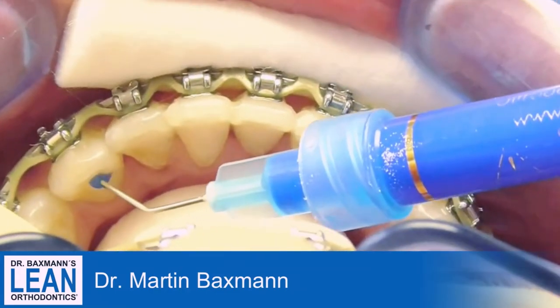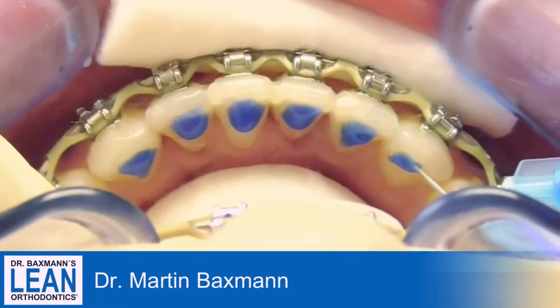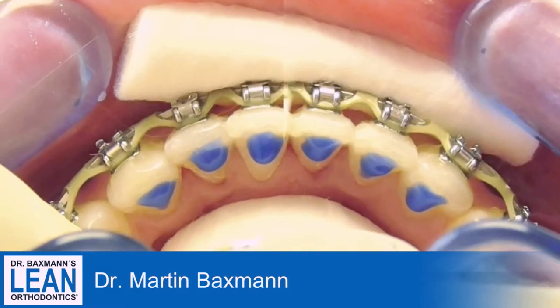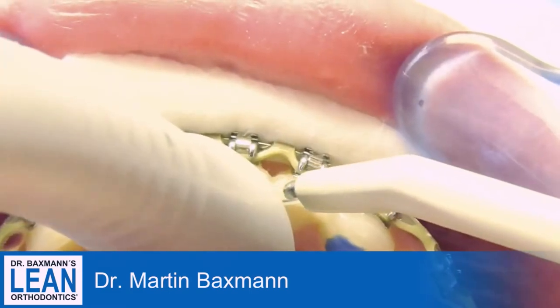The next step is to clean the teeth. Make sure that you clean them a few days or weeks before, so there is no gingival inflammation which will lead to bleeding.